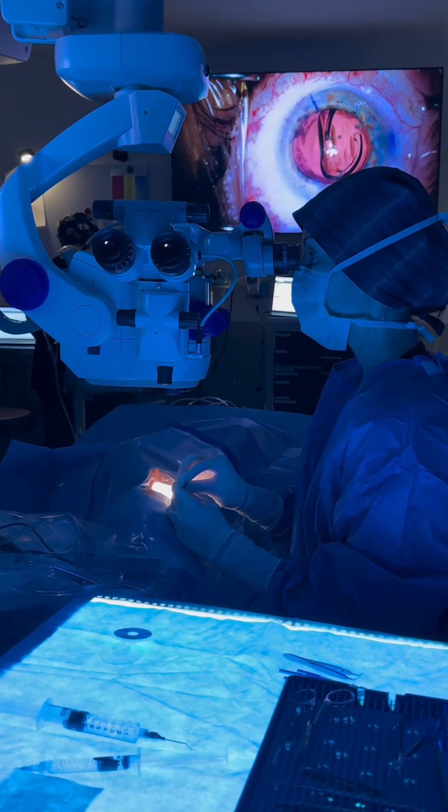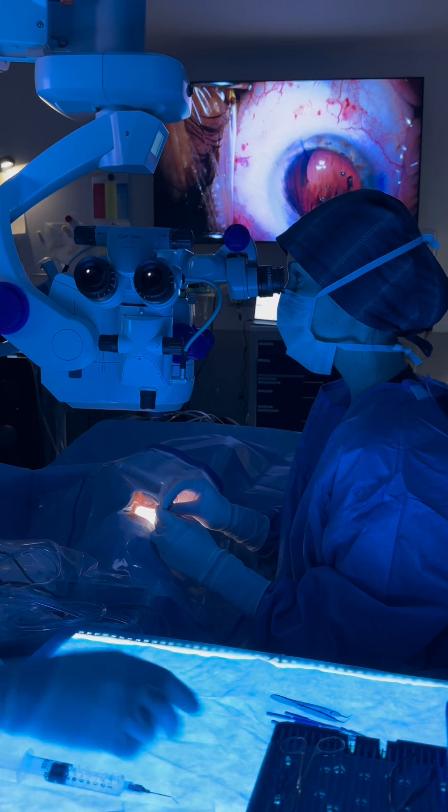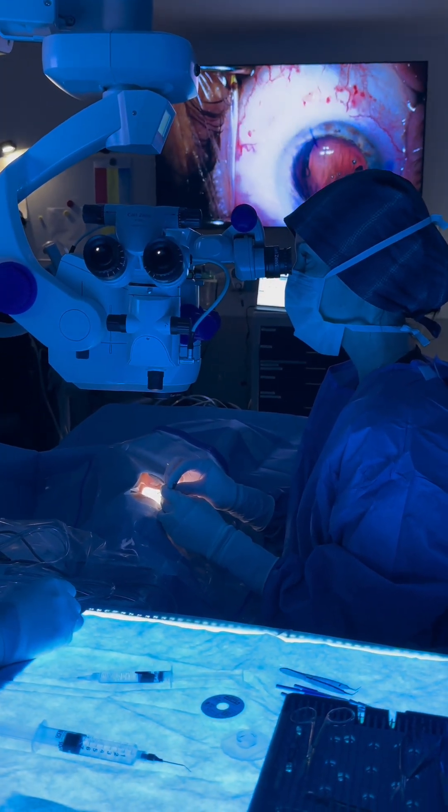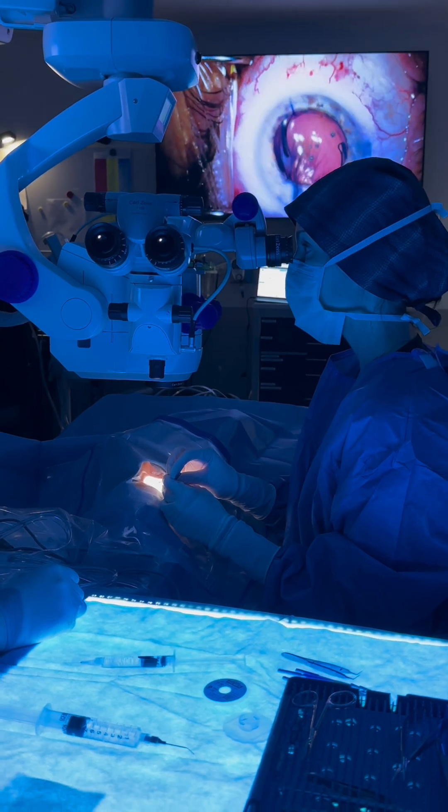We inject the lens into the eye and rotate it into position. It has the prescription built into it, and what it's going to do is fix the astigmatism and provide a nice range of vision.